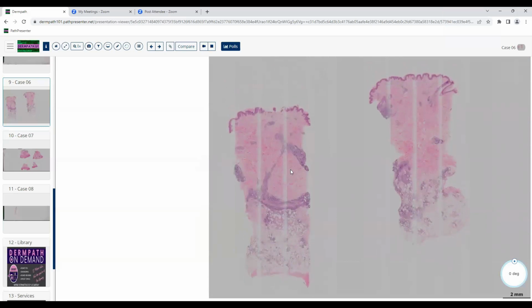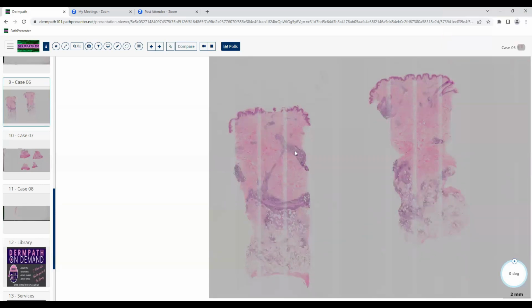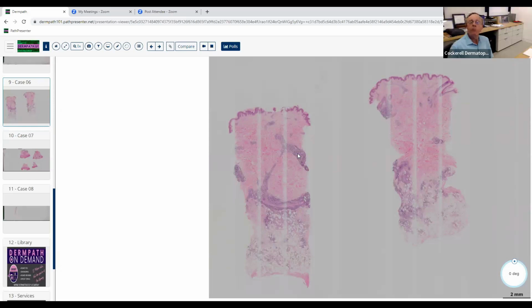Now, we've seen several inflammatory conditions today at low magnification. We saw the vasculitis, the nodular vasculitis, and the sarcoid. What kind of cells are we looking at here? I think we have a mix of lymphocytes, some histiocytes, and some plasma cells. Okay, but what's the majority of the cell here at low magnification? Lymphocytes, right around the vessel, but then I think histiocytes as well. What's the majority of the cell? Lymphocytes, maybe. Good. Okay, lymphocytes.